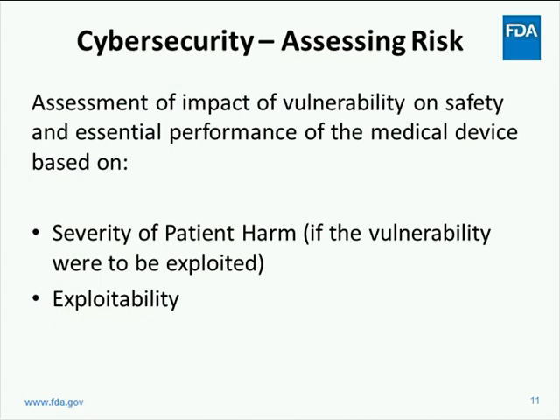The principle of the final guidance is cybersecurity risk management. The guidance provides a suggested risk management framework and assessment methodology which manufacturers can use to meet their regulatory obligations under 21 CFR 820. The assessment methodology combines concepts from the FDA-recognized standard ISO 14971 and the Common Vulnerability Scoring System, known as CVSS.